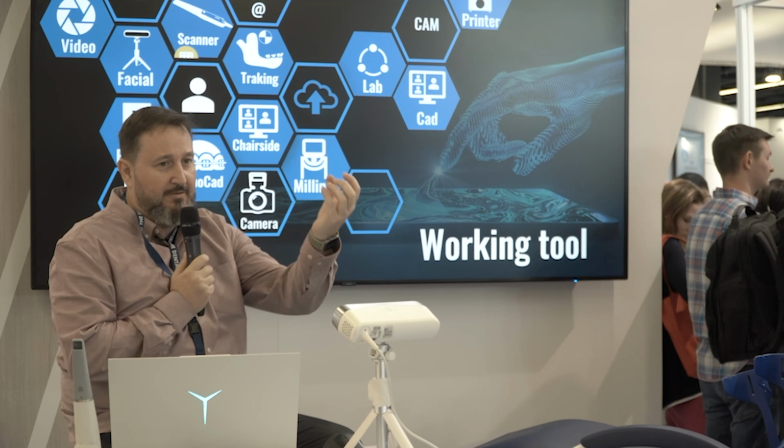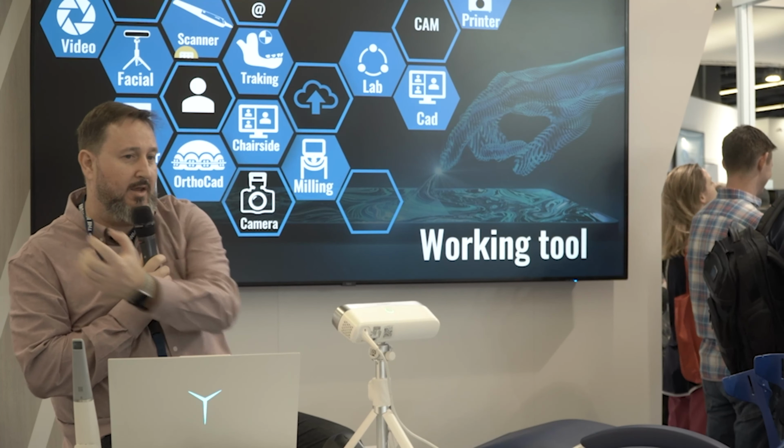I take it manually, I have to cast it, I have to pour, I have to send it, and this is manipulation times, and this is a manipulation way of doing. So when it comes to the lab, I will have these same issues, because I have to manipulate it too. So if I have something digitally, why do I have to convert it to analogical to then scan it again and convert it digitally again? So this is a very annoying job.